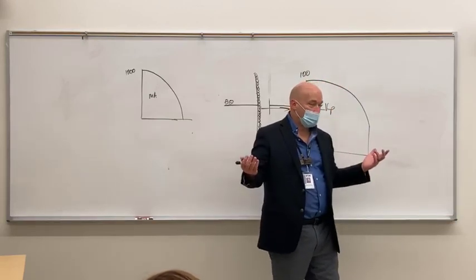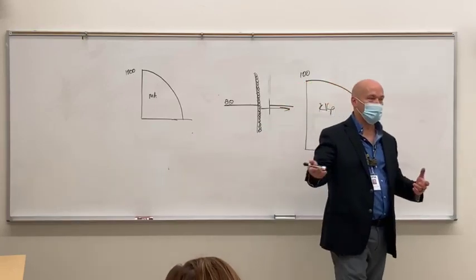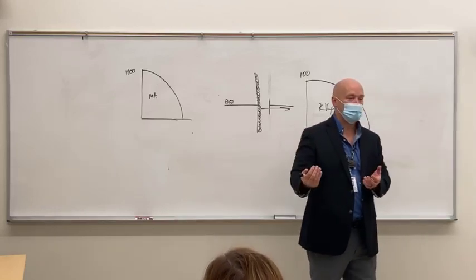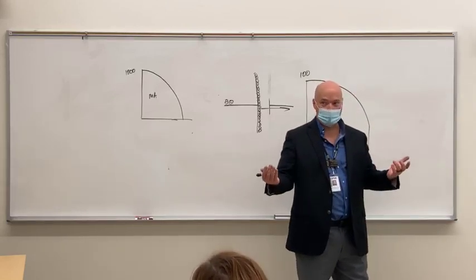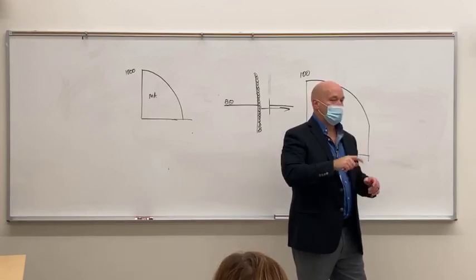Don't ask me how, I don't know. I don't really care. You just need to memorize it. It's always at 0 if it's wired dead square into the secondary side of the high voltage generator. It just is, okay?